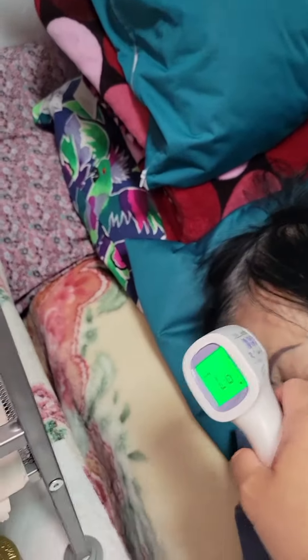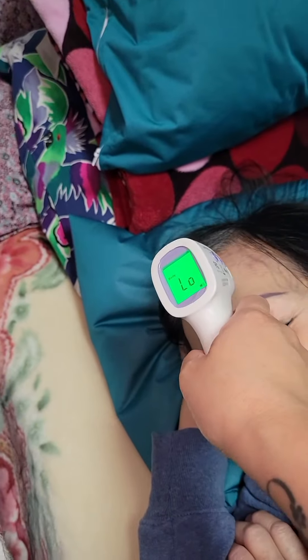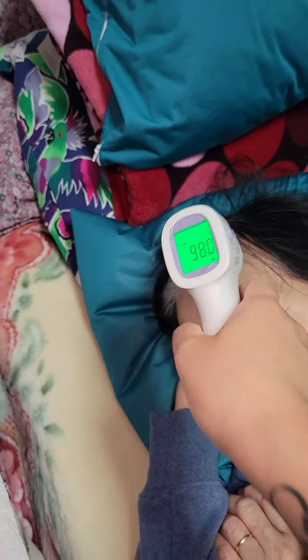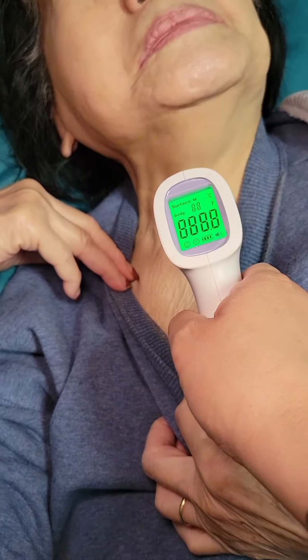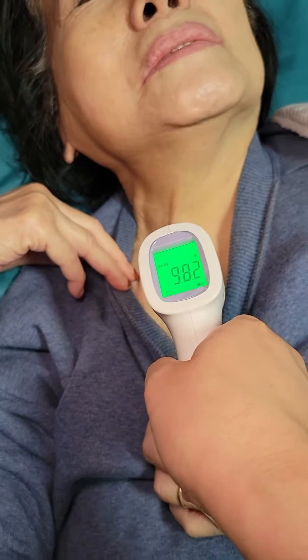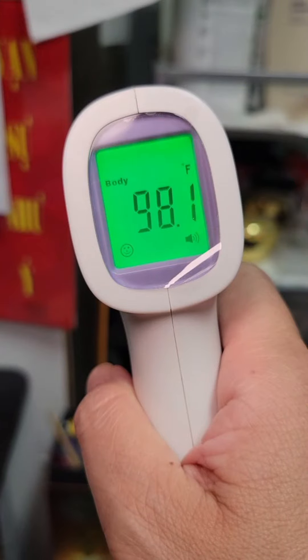Right now my mom is not feeling well, so I'm going to use this on her to check. You can do a measurement on her forehead — it looks good, no fever. I'm also going to check her neck just to make sure, and that looks good too.